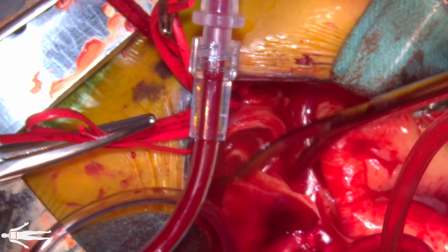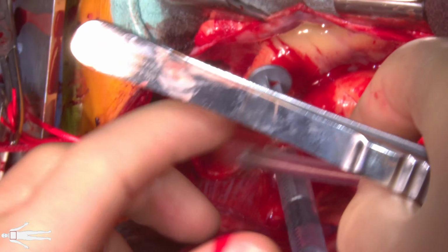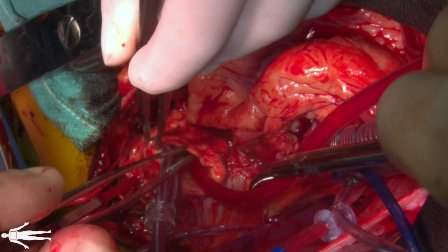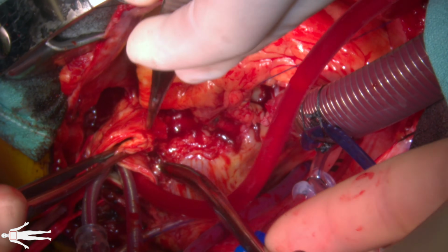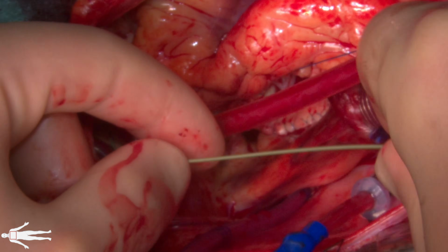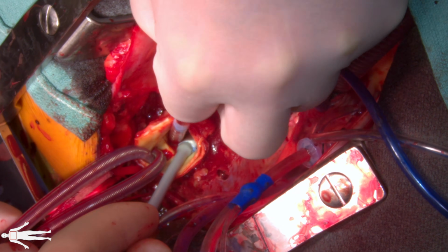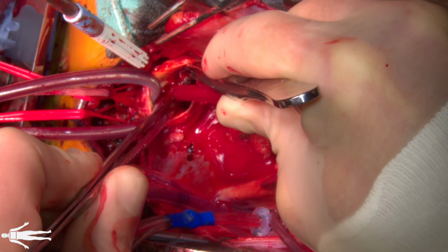The aortic cannula was removed and the aorta was transected up to the level of the innominate artery. A balloon-tipped perfusion catheter was then inserted into the innominate and left common carotid artery for antegrade cerebral perfusion. The aortic arch was then inspected for any entry or exit tears. None are noted. A Benson wire was then advanced down the true lumen of the descending aorta, and a Gore conformable thoracic stent graft measuring 31 millimeters by 10 centimeters was deployed in an antegrade fashion.